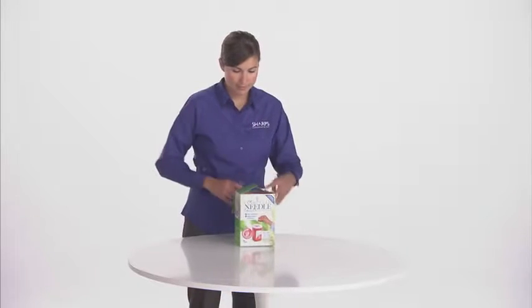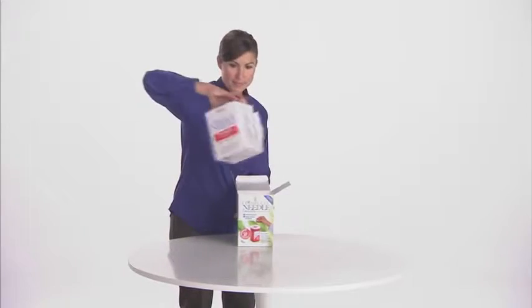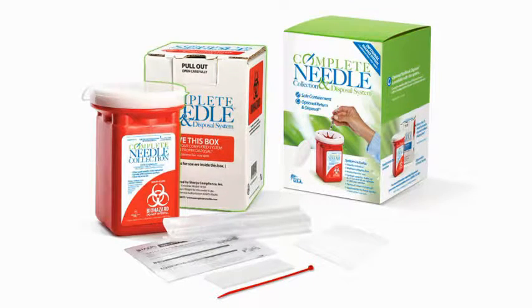To begin using your Complete Needle Collection and Disposal System, remove it from the outside box. The Complete Needle System includes the pre-approved return shipping box, a red sharps container inside a plastic bag, an absorbent sheet inside the container, instructions for use in English and Spanish, tape, and a twist tie. Save all components for packaging the system when the container is full.